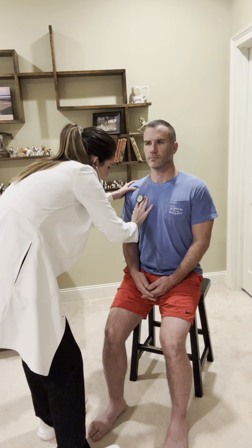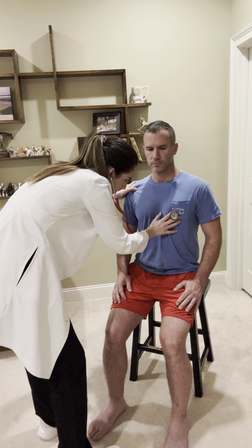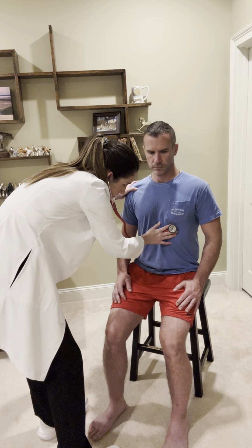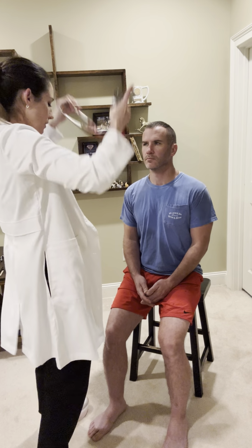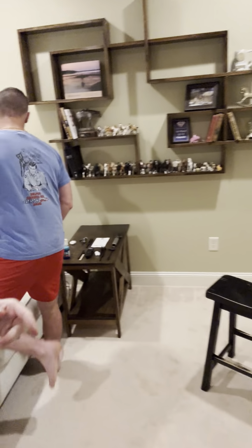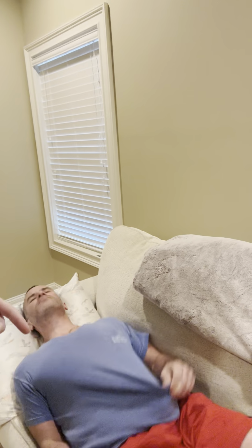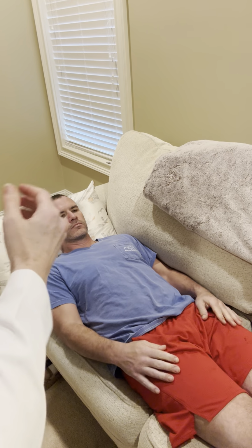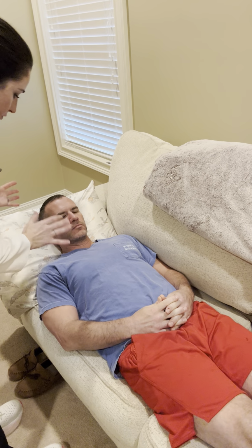We'll listen again with the bell, aortic, pulmonic, Erb's point, tricuspid, mitral. All right, I'm going to let you lay down on the couch. All right, so we'll have the head of the bed at a 30 to 45 degree angle.